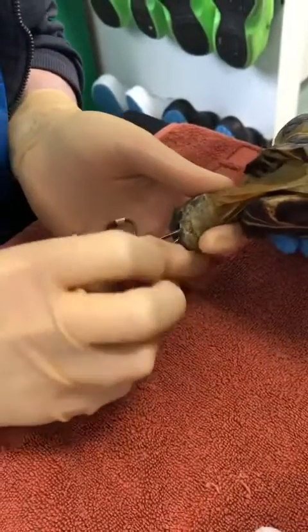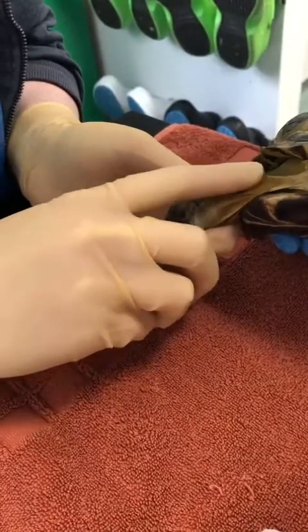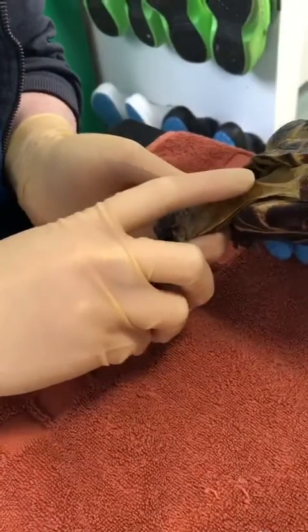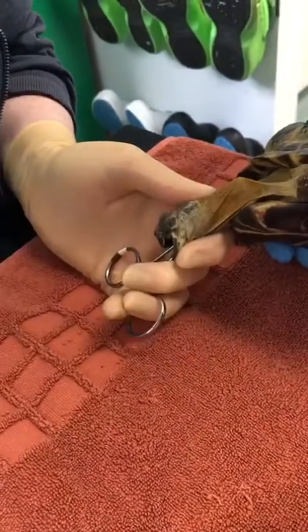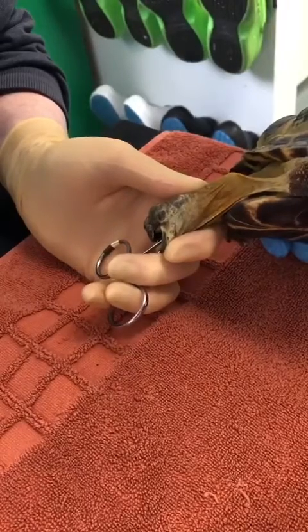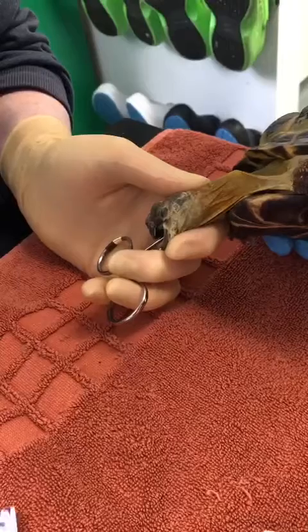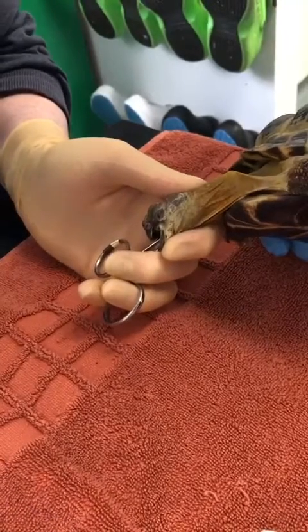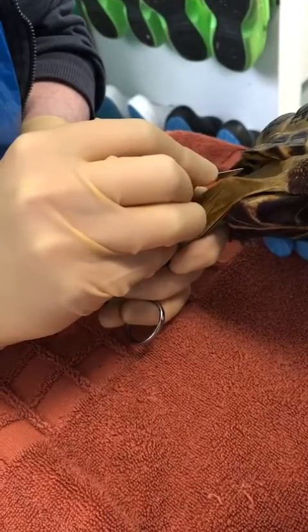We then tent the forceps up against the outside of the neck. So we're in the esophagus — on the outside of the neck we want to move away the carotid artery and the jugular off the point of your artery forceps. Then, using our scalpel, we want to incise over the top of our artery forceps so they can poke through.